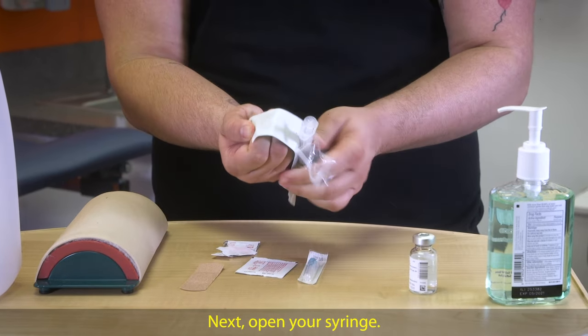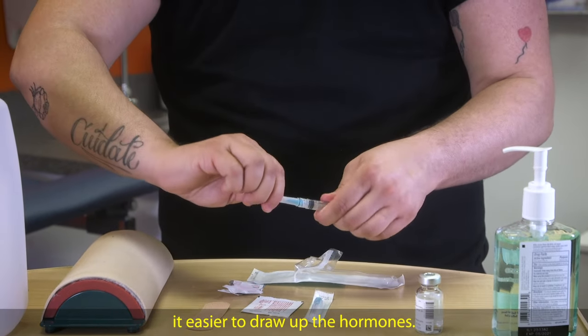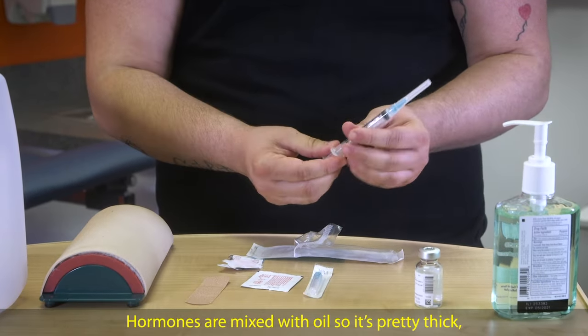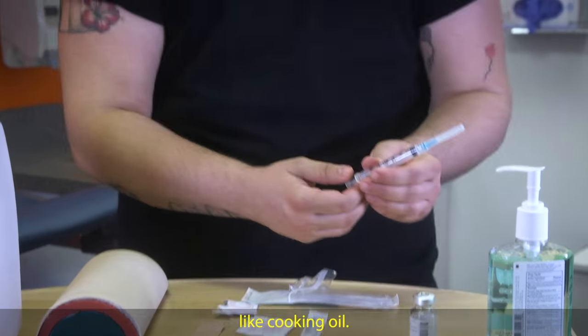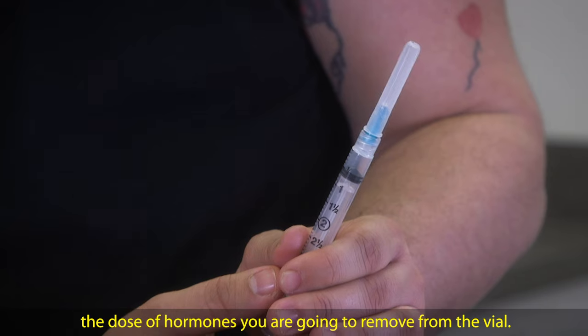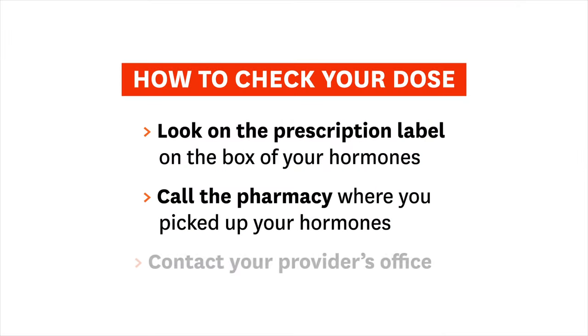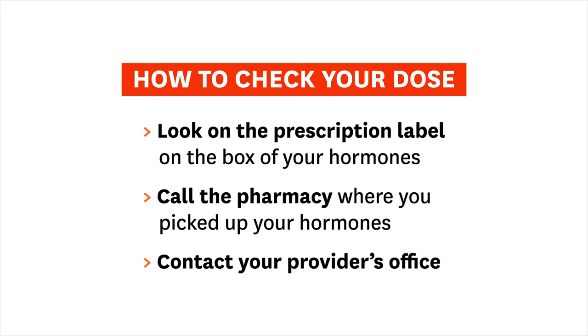Next, open your syringe. It will come with a big needle to make it easier to draw up the hormones. Hormones are mixed with oil, so it's pretty thick, like cooking oil. Pull down the plunger on your syringe to the dose of hormones you are going to remove from the vial. If you're not sure of your dose, you can look on the prescription label on the box of your hormones, call the pharmacy where you picked up your hormones, or contact your provider's office to double check.